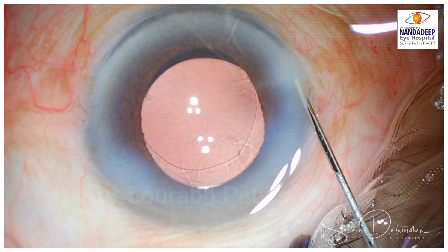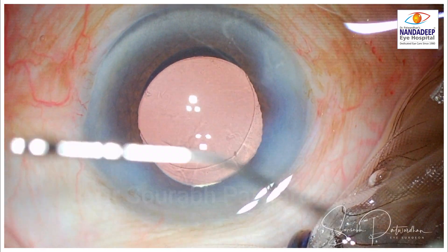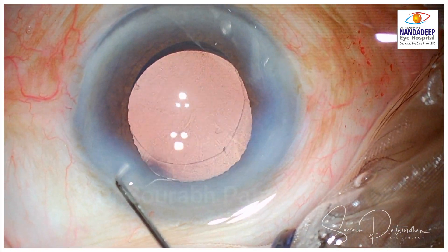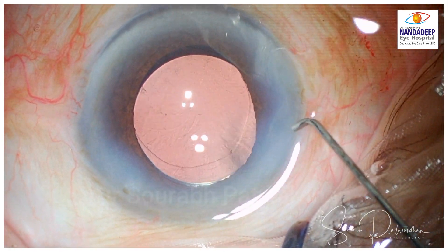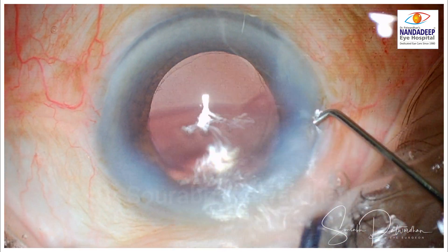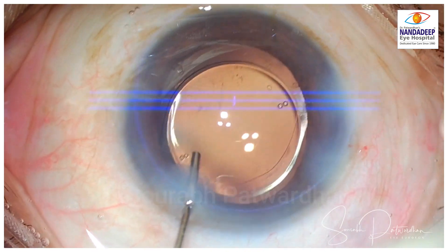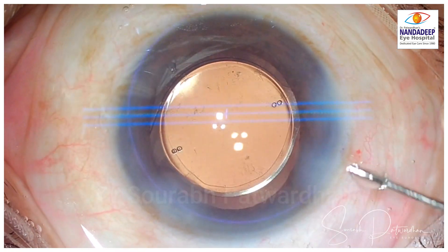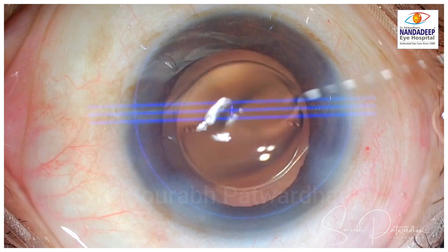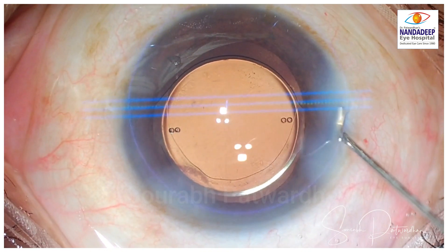Now this is my standard 1 cm bent cannula, which I'm used to for hydration — and both cannulas work perfectly for incision hydration. Whenever you change any device design like this cannula, it takes a few cases to get used to it. This kind of cannula may be more useful for hydro dissection in shallower anterior chambers where you can navigate under the capsule more easily. For IOL rotation I used the 1 cm cannula because of its longer length, but you can do it with the 1 mm cannula as well.